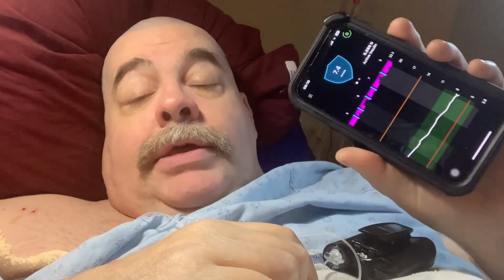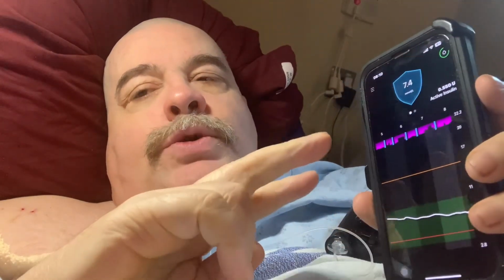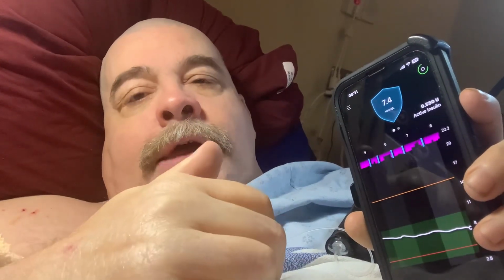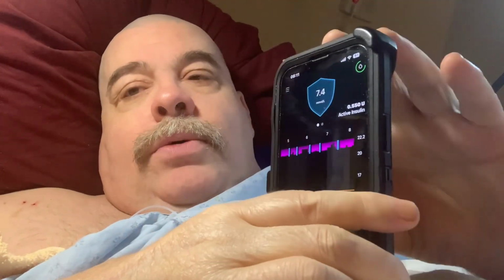I can't speak for the other pumps because I've never really had. I had one pump back when they were so basic. And ever since I've had the automatic shutoff, it saved me quite a bit. Trust me. Now, there's two ways this controls blood sugar. There's the manual mode and there's the auto mode. Manual mode is pretty much how every insulin pump works. You see it, you type in a number, it'll give you your insulin that you requested.